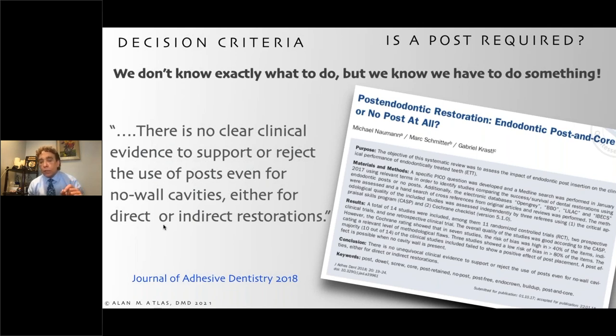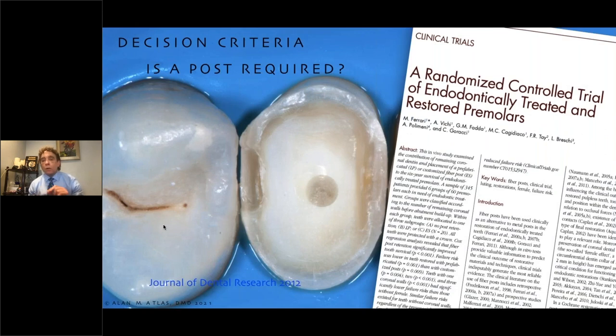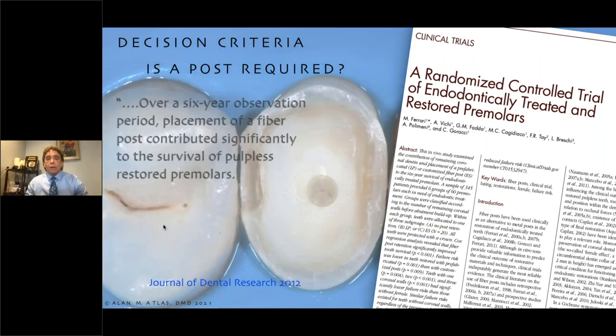So what I will tell you is that when we place a post, I look at all these different studies. And this group in Siena, Italy, led by Dr. Ferrari and my other good friend, Professor Grandini, who I will introduce to you in a few minutes, have done a plethora of studies on these types of situations. So when I want to know truly what's going on and how to handle endodontically treated teeth, I look at this group led by Professor Ferrari. They did a 6-year study, a great time sequence of observation, placing a fiber post in pulpless restored teeth.